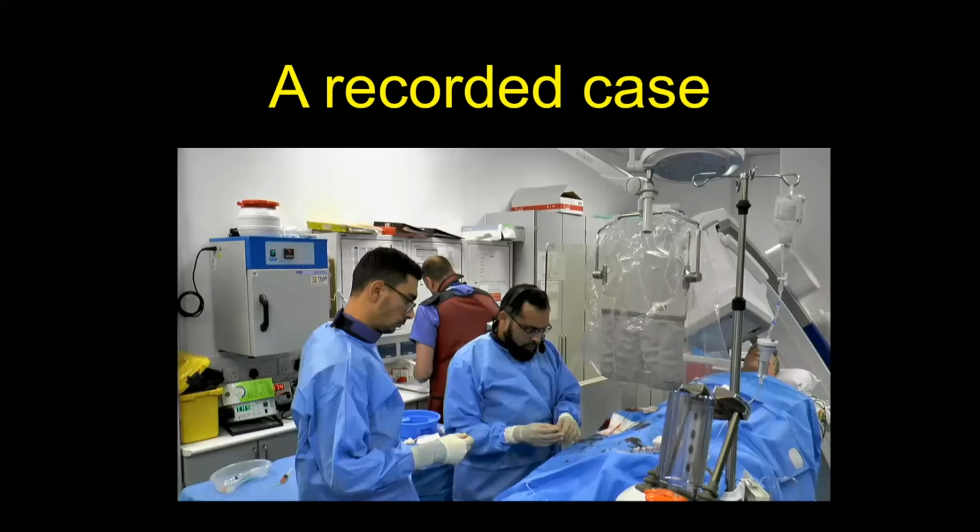There were some studies, I think the SECRET trial, where a 65 micron stent was used for plaque passivation, and a couple of other small studies, but no proper randomized trials. But my personal feeling is that for these non-flow limiting but ruptured plaques, it's medical therapy.